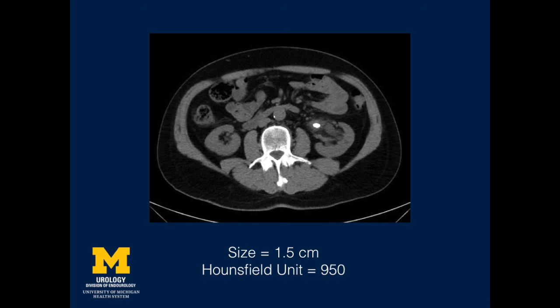The third case is a patient with a 1.5-centimetre renal-pelvic stone. Despite using a dusting approach, some stones may break up into large fragments. If that happens, we herd these fragments into a dependent calyx. By using the scope to move and push the stones into dependent calyx pockets, the stones can be dusted more effectively.